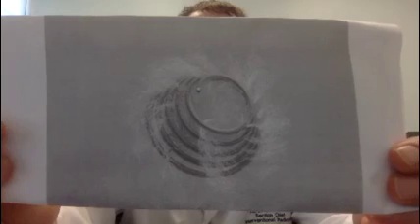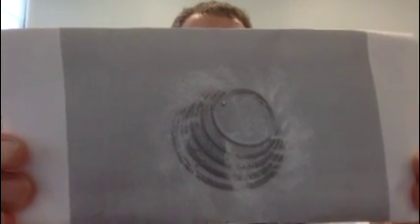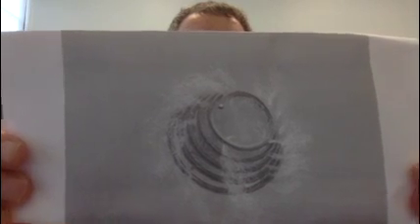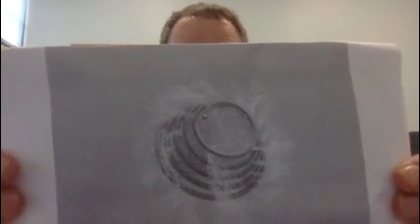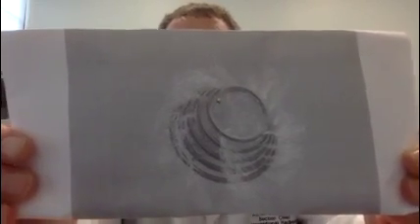The first is a coil, and this is an example of a tornado coil. You can see it has a tornado shape and it has all these fibers or hairs on them, and they help block the blood flow. They cause clotting when those fibers are in a blood vessel. We use those oftentimes in trauma cases to block off vessels that are bleeding, GI bleeds, etc.